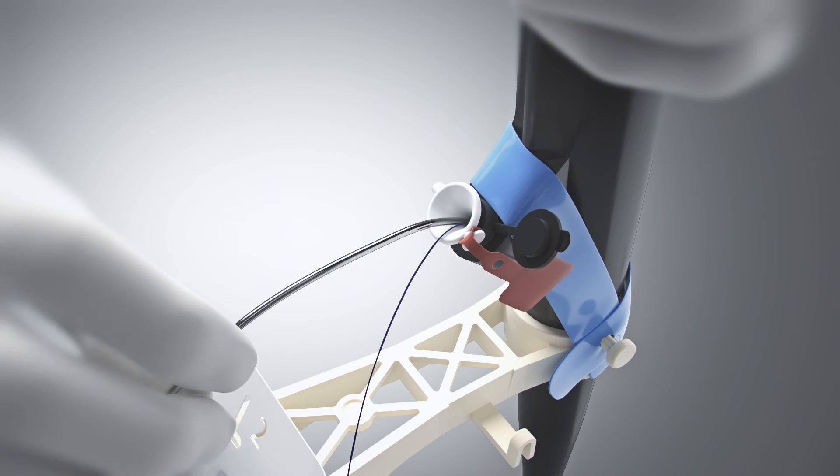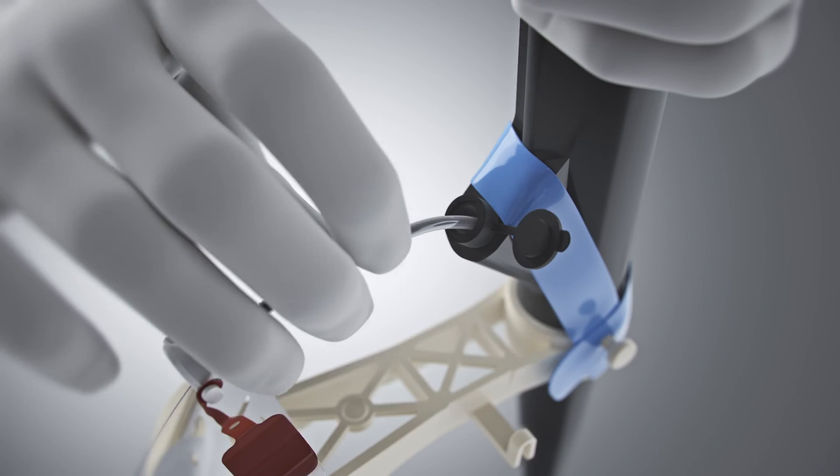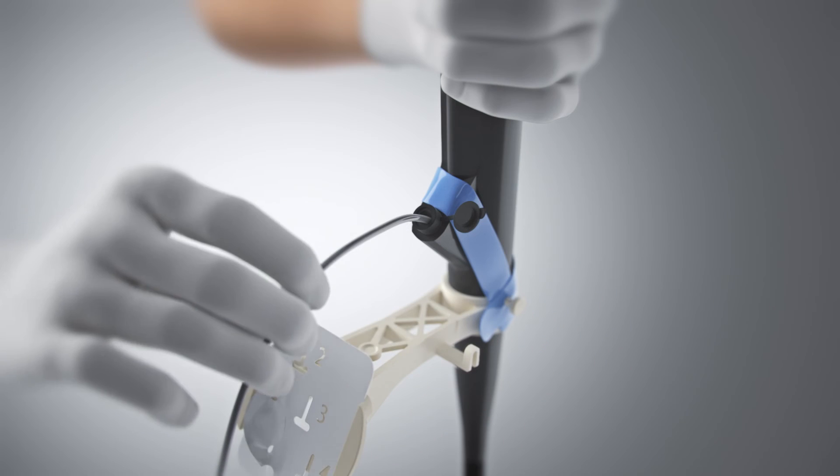After the fourth and final helix TAC placement, remove the device catheter and scope liner from the working channel, leaving the suture in place.